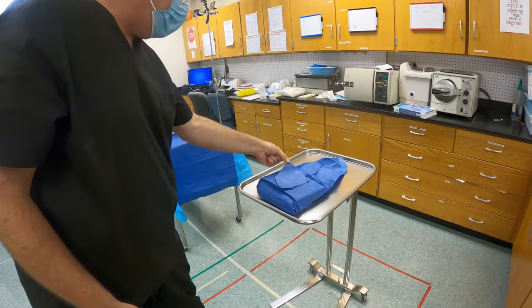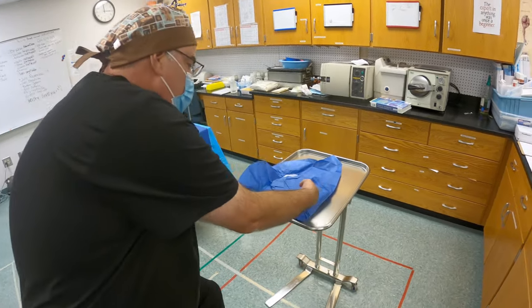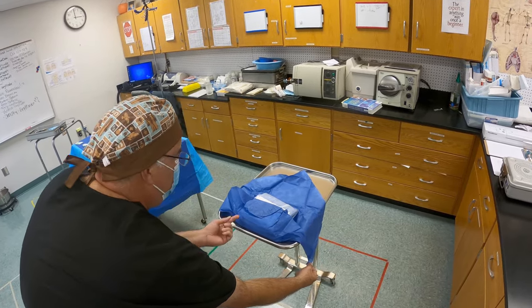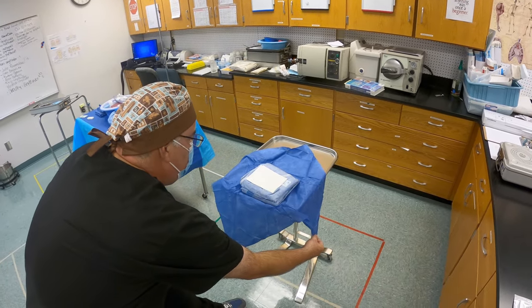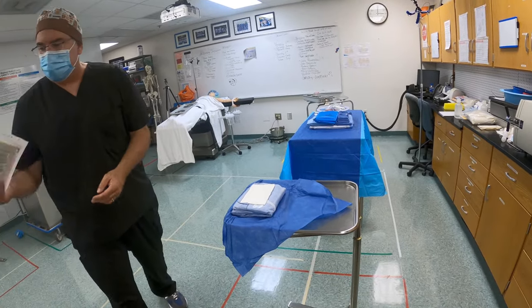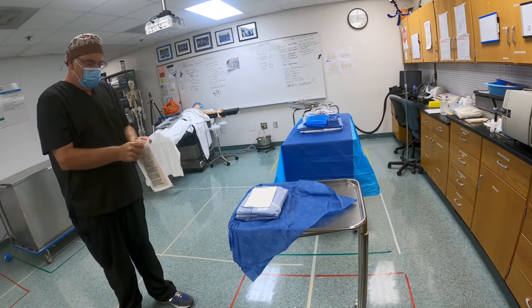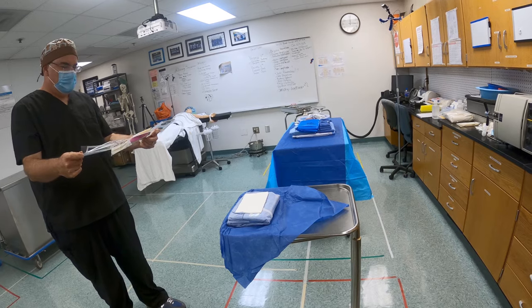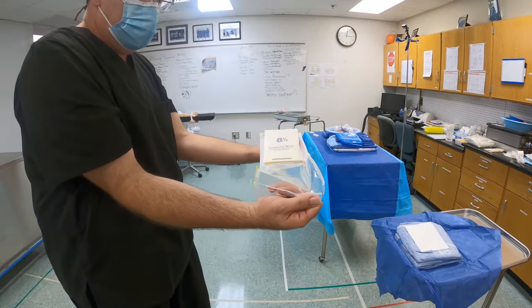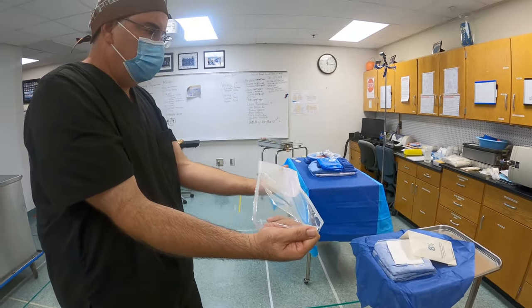Find the corner of this side, open it down. I like to keep one hand on this one as I come in to grab the other one — pulling this one down this way so nothing comes back at me. I'm going to keep my fingers on this one as I open the next, pull it down. Next thing I need are my gloves, which I have here — this is the first set of gloves I'm going to use. I take my elbows, turn them in real tight, point my palms up, and then flip the gloves onto the field.